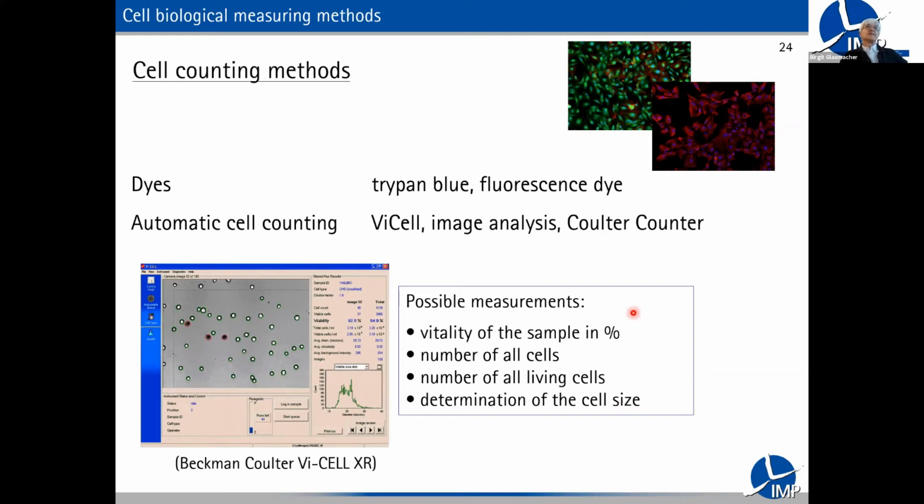We can see this. I'm always a little bit concerned about the dyes, whether they really do not change any properties of the cells. So I really like to find other methods, not to have to dye the cells. So try to do the reproduction cycle after thawing.